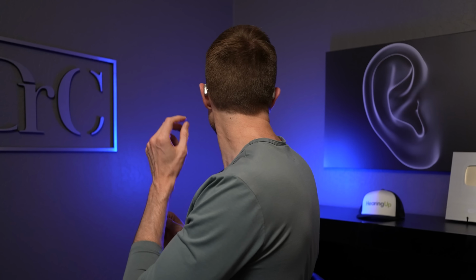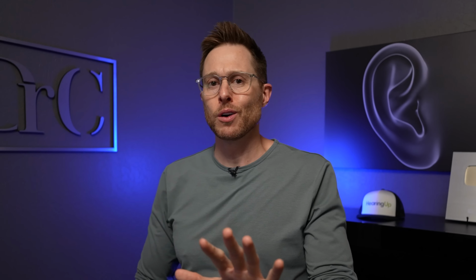Let me spin around the other way, one of the benefits of a swivel chair here. And that's essentially what it looks like behind my ears, and that's from the side. You can see I'm poking out the back a little bit. I do know that silver is not my color. I'm more of a sand beige or sandalwood color because that blends in with my hair better.